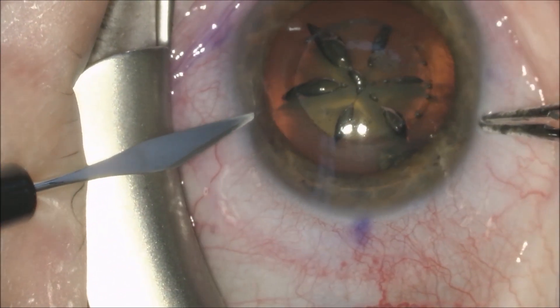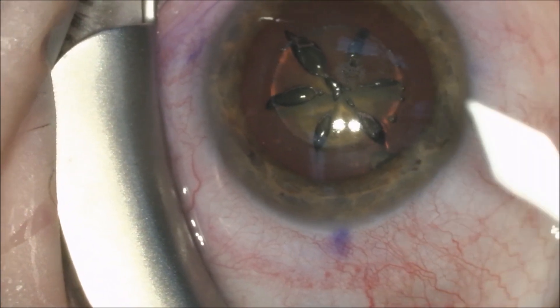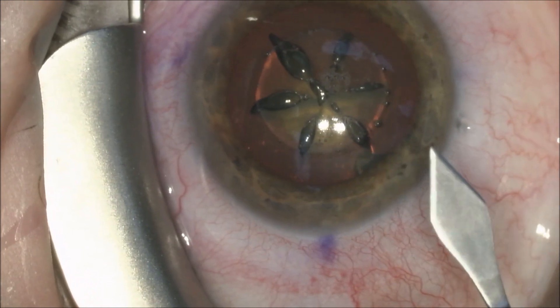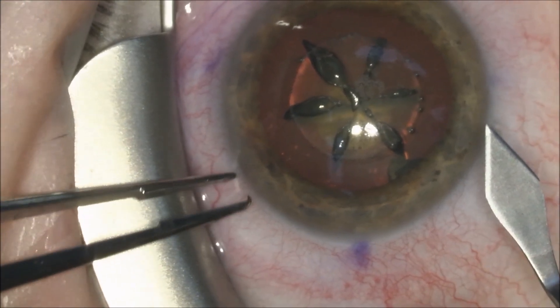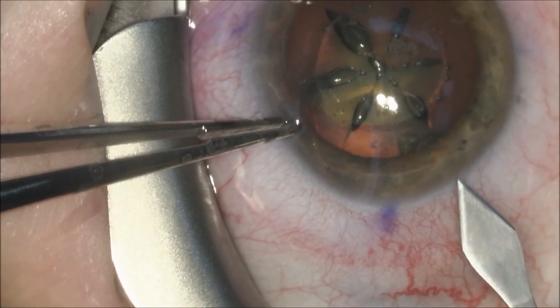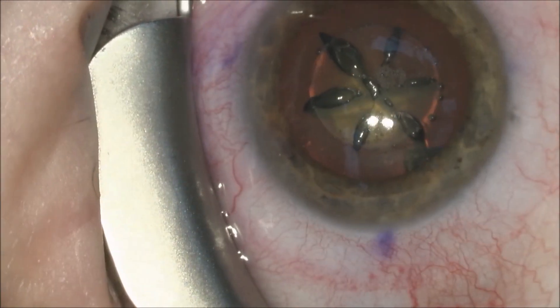I prefer doing manual incisions using my standard 15-degree super sharp blade superiorly, and we will do temporally a 2.4 millimeter single-planed incision using a double-beveled keratome of 2.4 millimeters.